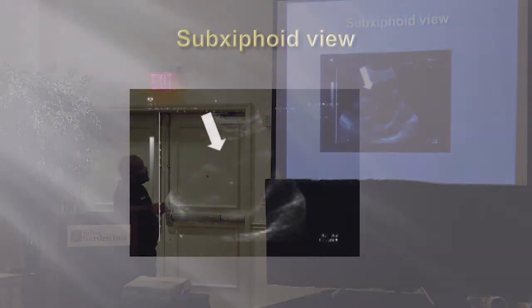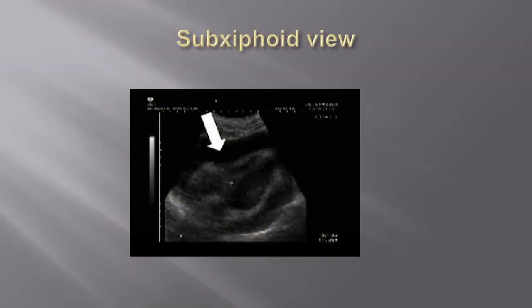All right? Okay, so you can't see this very well, but this is right atria, okay? You can barely see the right ventricle here, and this is a large left ventricle here, and a lot of fluid around it, a lot of fluid around the heart. What is this? So if you ever walk up to me and show me this and go, hey, this guy's got tamponade, what do you think's gonna happen? Probably gonna punch you in the face, all right?